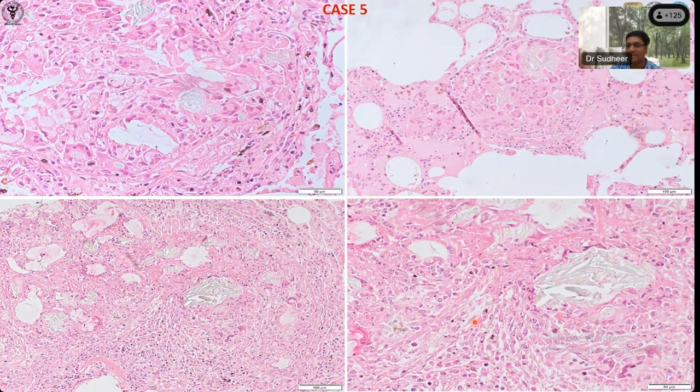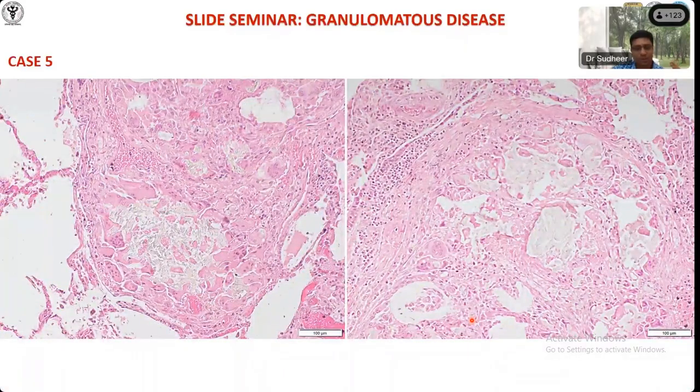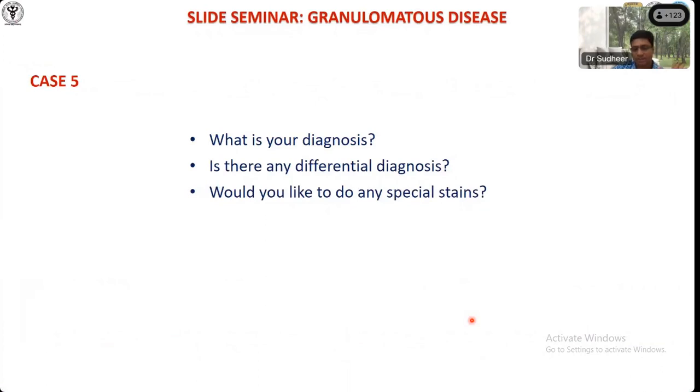You should always think the history will solve your problem. Sometimes in IV drug abusers, talc is very common. Talc, yes, if they mix with this one. There is a bluish material sometimes you get. There are some of the other excipients, solvents which are added with the drugs. There are some polymers, sometimes you get that. But this is invariably polarized and you will find it. Yes. See this? All the blood vessels are flooded with this foreign body granulomatous reaction.